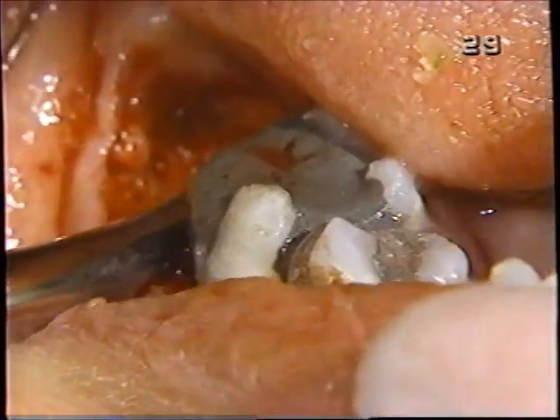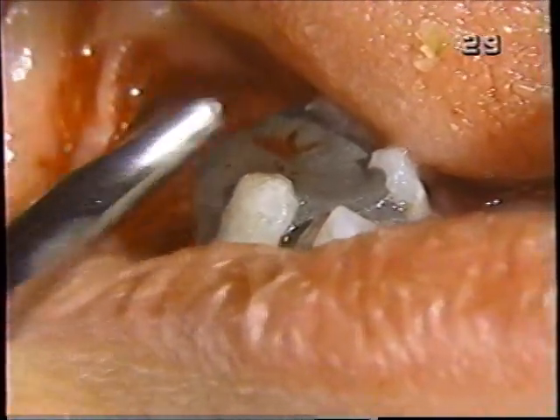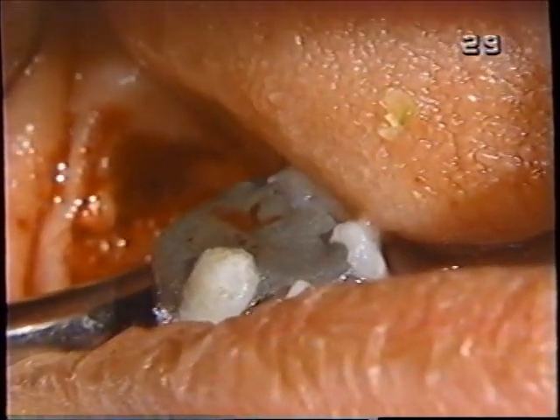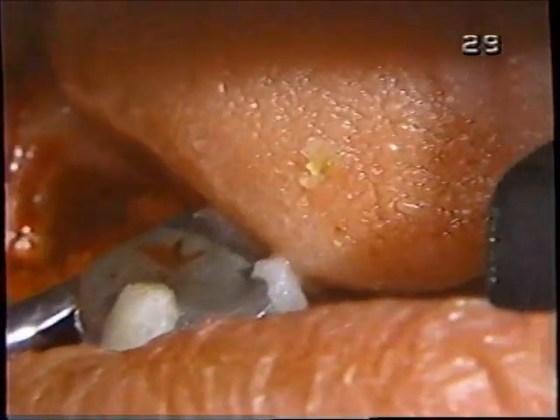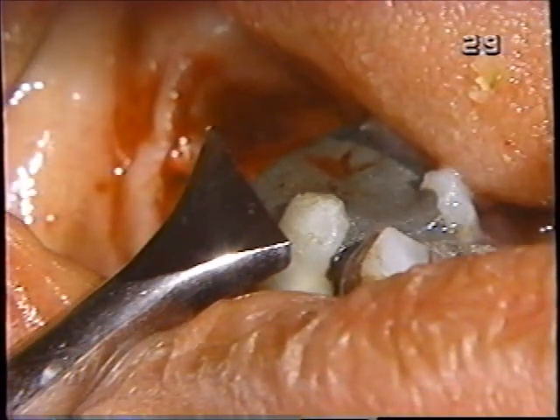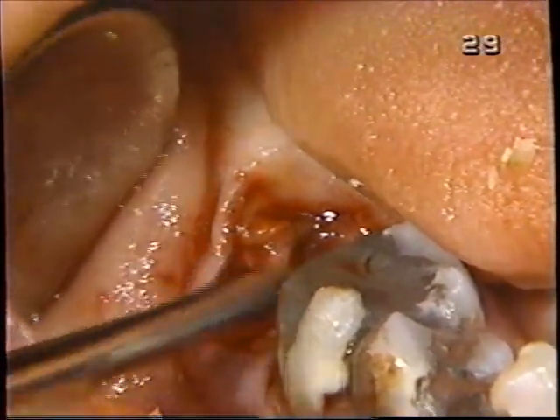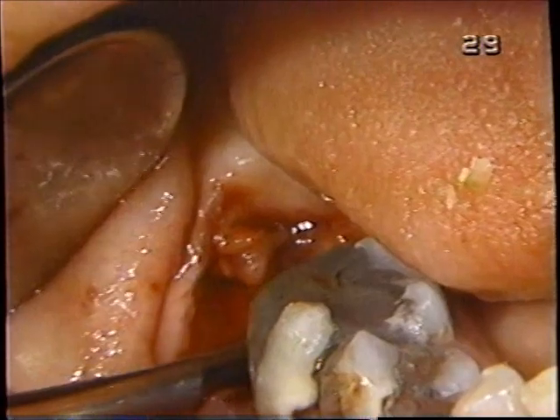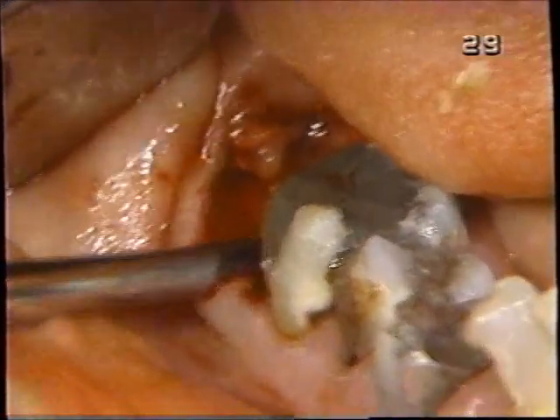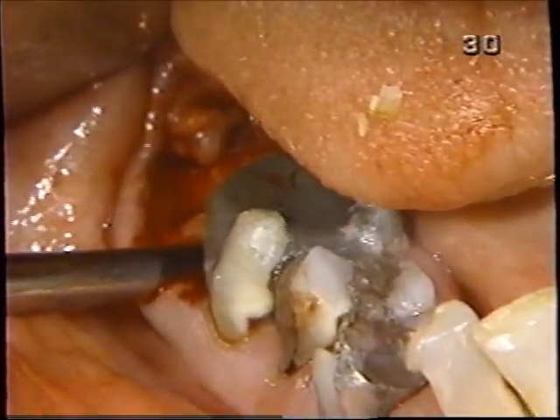If we try to engage that root with this size Cryer, or east-west, whatever you want to call it, you can see the fulcrum is actually the tooth in front. And yes, we could maybe angle it, but then we lose our mechanical advantage. It's better if we can use the small Cryer. And now with the smaller Cryer, we fulcrum off the other root, or maybe the interseptal bone instead of the tooth itself. We're trying to engage that root.